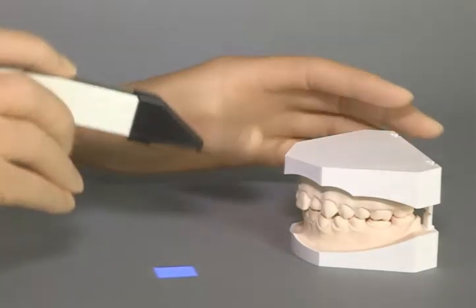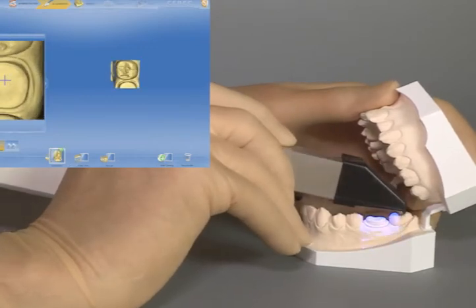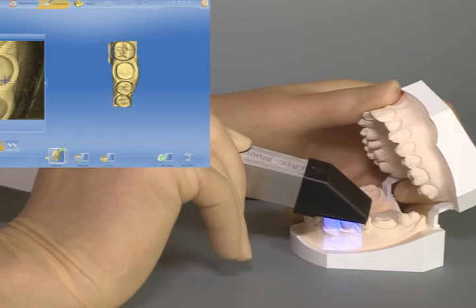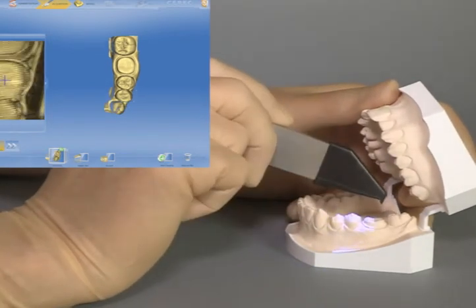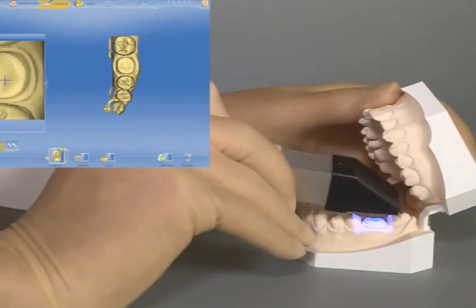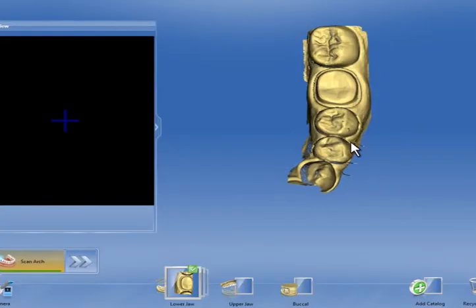We start with the lower jaw. Distal on tooth 3/7 with overlapping scans forward to mesial. We tilt the camera slightly buccal caudal to ensure we capture sufficient buccal facial surface for buccal bite registration. Proximal contacts of the neighboring teeth so that any undercuts are also shown. This facilitates a better design of the interproximal area. Now check the model.